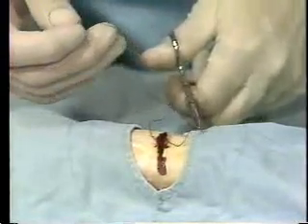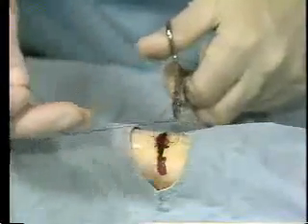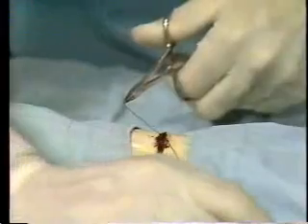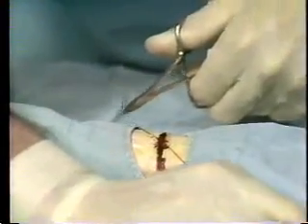Pull the free end through the 3 loops and tighten to form the first knot, pulling the short end in the same direction where it lay after pulling it through the loops on the needle holder. The free hand pulls the needle end of the suture in the opposite direction.